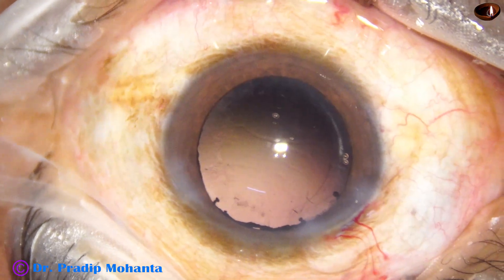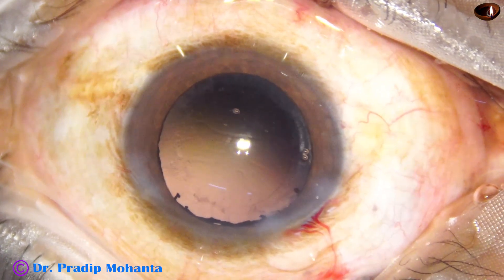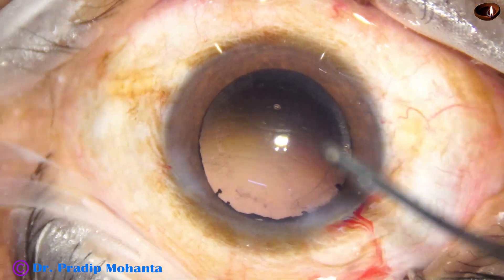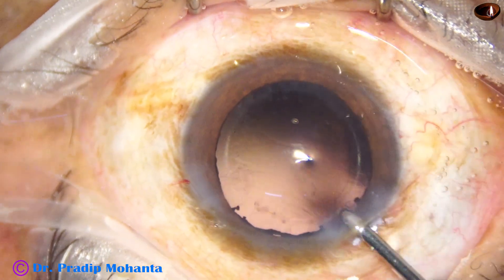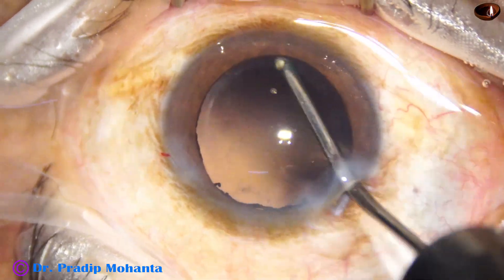Cortical cleanup has been done with a 23-gauge Simcoe cannula. Now this is polishing of the posterior capsule by the irrigating cannula.